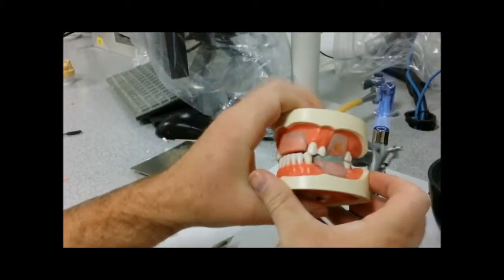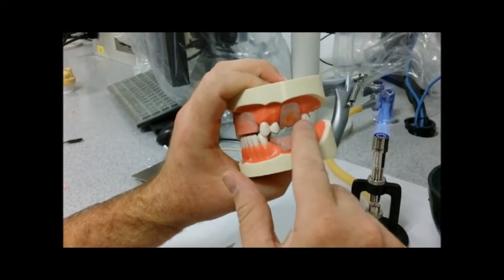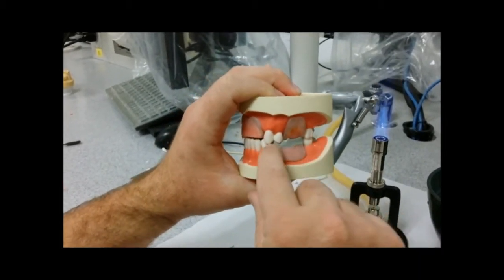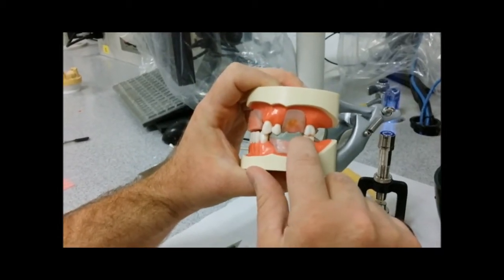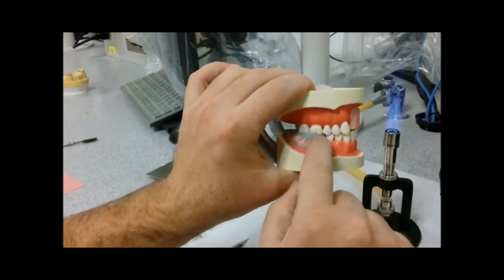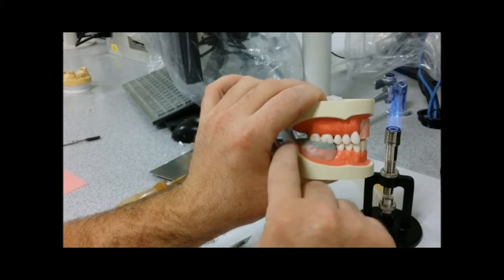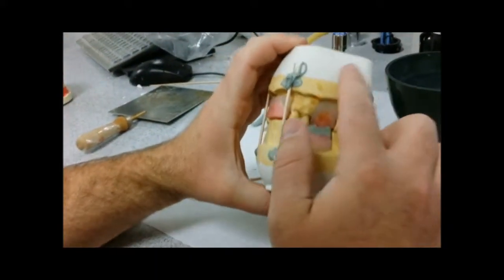So then when you look, you bite down on it, it's going to flow outside of it. Once that hardens up, you're going to take the razor blade and smooth all this up so it's flush and you're going to look inside this edge and see that fills each little groove perfectly. Well the same side over here, it hits these teeth, you can see it hitting the teeth and it's all flat and smooth. In order to mount the mandibular together.